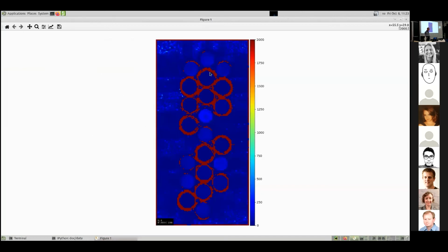By clicking the mouse over, you can see the intensity in the right corner, and also X and Y coordinates. You can see there are different values. And it's of course still possible to change the window level like we are used to in a grayscale image, to be able to see something like this. Okay.